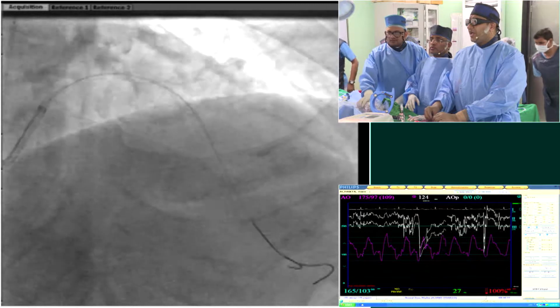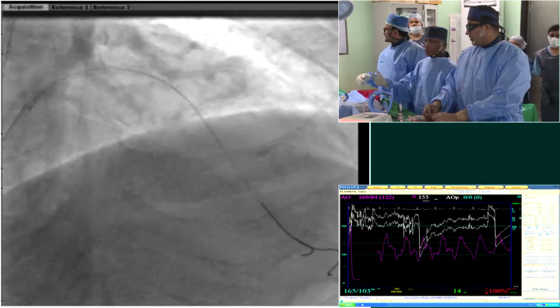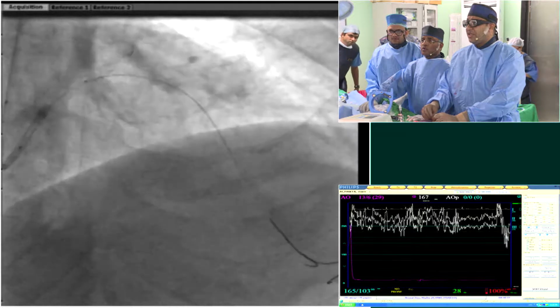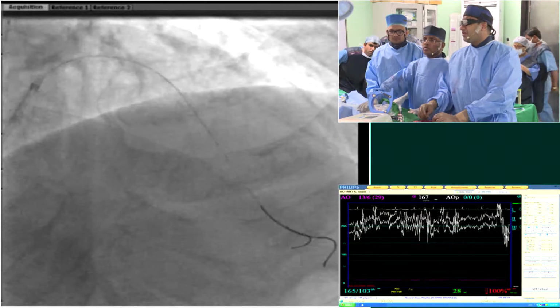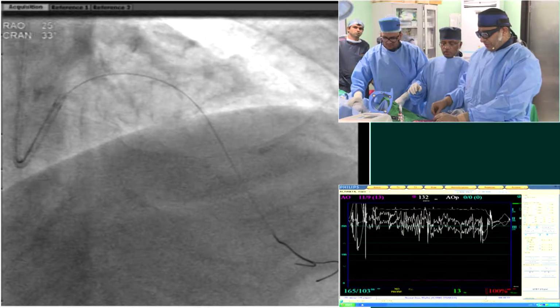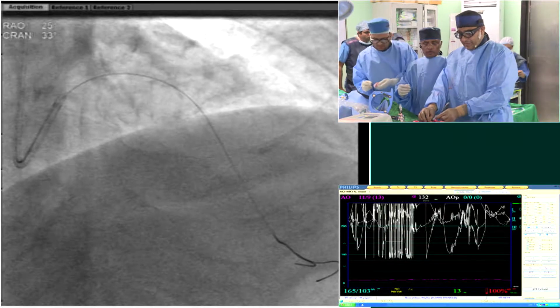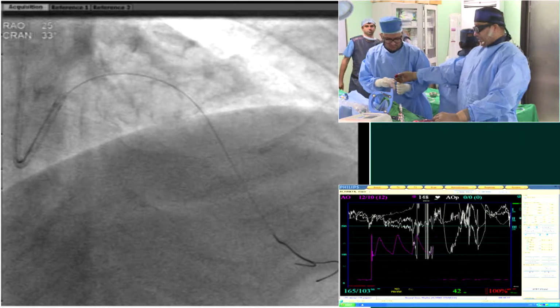I think we need another catheter. The catheter is gone, I feel. One more catheter. Why should the OCT catheter not go? Come on, it has to go. Okay, I'm going to take a Flextome because I can't get the OCT through. Sure, Flextome scoring. Upsize the Flextome. Can you give the Flextome 3.0? Yeah.